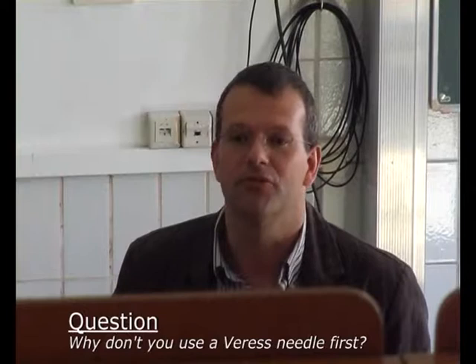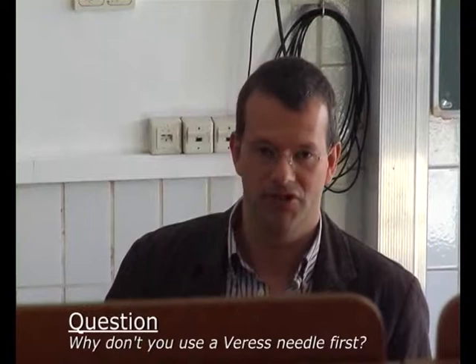Why don't you use the Veress needle anymore? Does it take too long? So we lose so much time. The insufflation with a Veress needle often needs 5 or 10 minutes. And with a 5 millimeter trocar, only a few seconds.